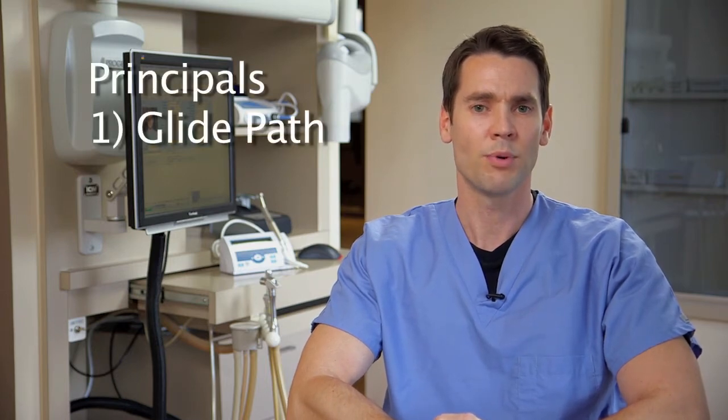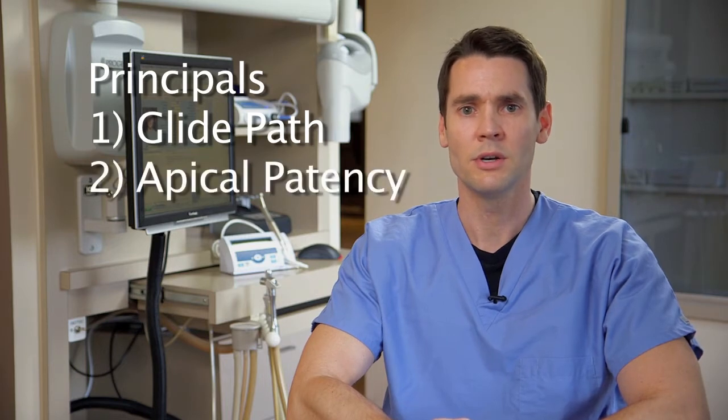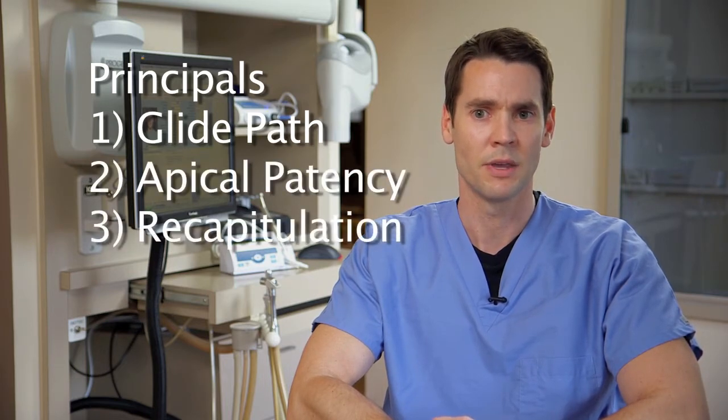Regardless of which engine-driven instrument system you use, there are three main principles that I must maintain throughout the course of my treatment in order to achieve a predictable outcome. Number one, the preparation and maintenance of a glide path. Number two, achieving apical patency. And number three, recapitulation.